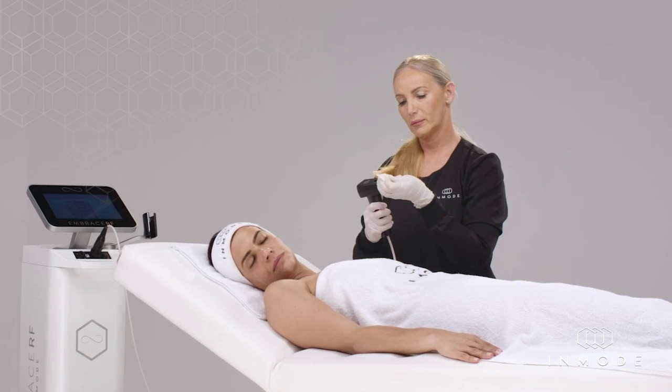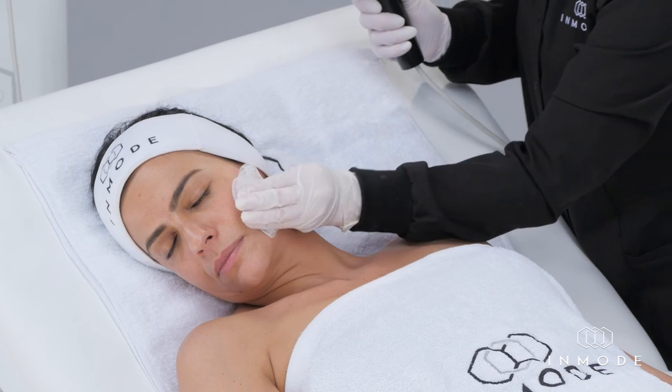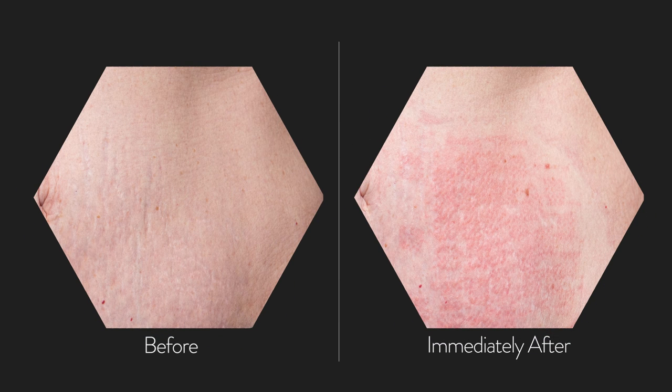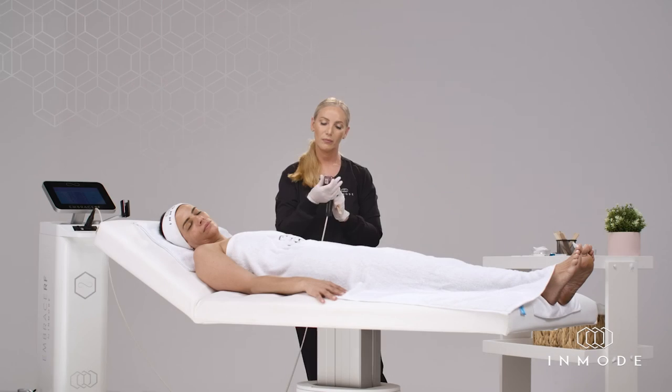If required, clean the tip as well as the patient's skin with clean dry gauze frequently to remove blood, debris, or sweat. The endpoints are minimal to substantial: some erythema and edema, often accompanied by a tingling heat sensation. Minor pinpoint bleeding may be observed.